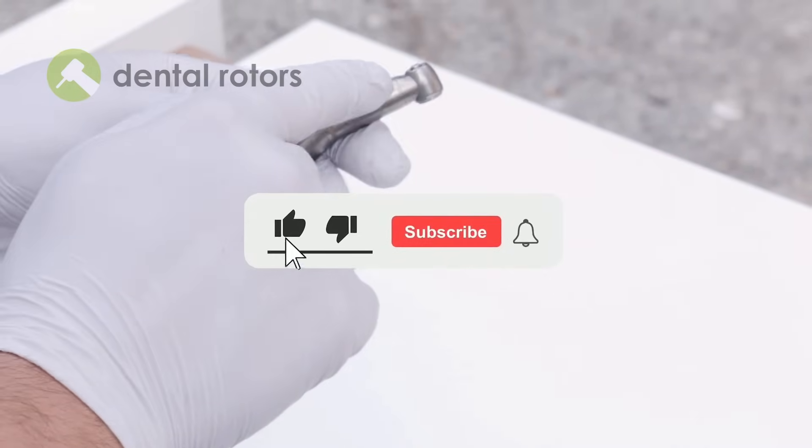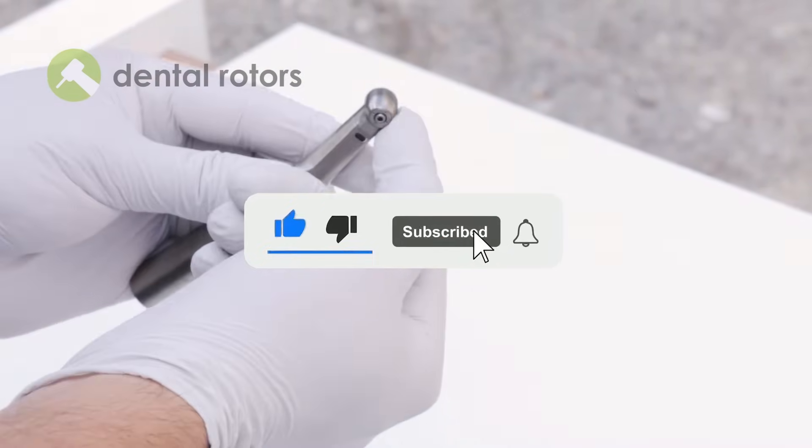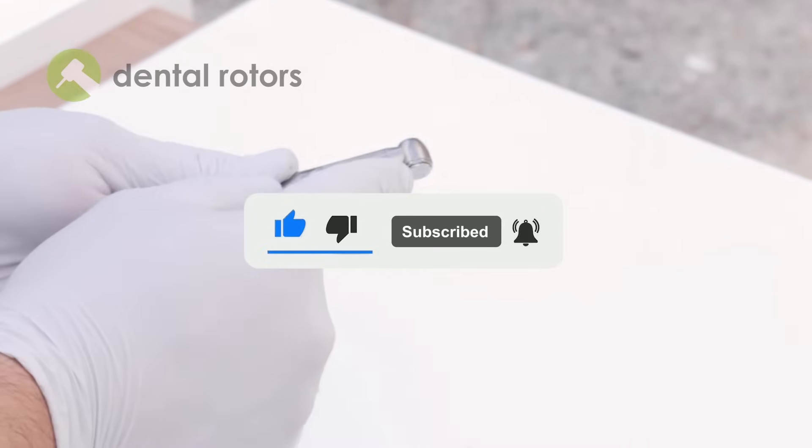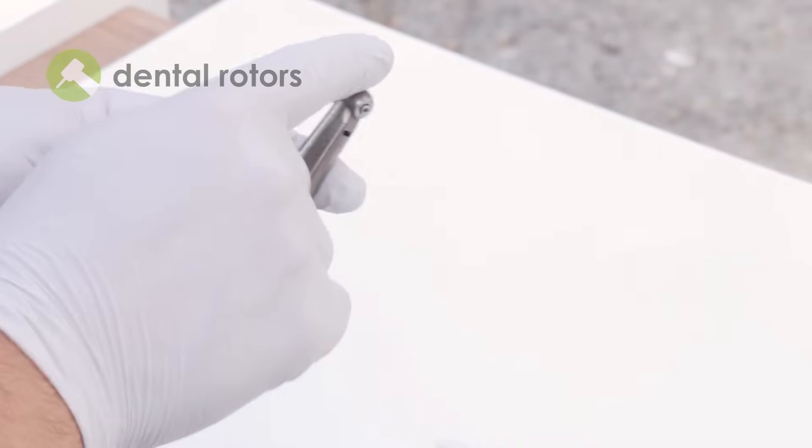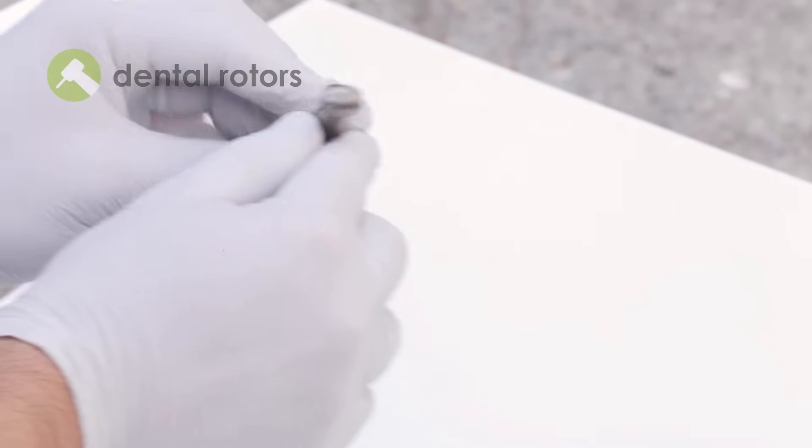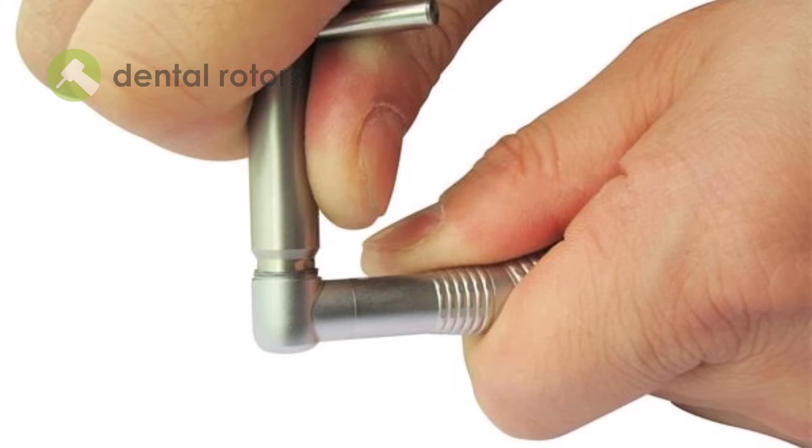First, carefully check the head of the handpiece for any dents or visible damage. If there are dents, you may have difficulty removing or installing the new cartridge. In such cases, we recommend using a special head expander available on our Dental Rotor Store.